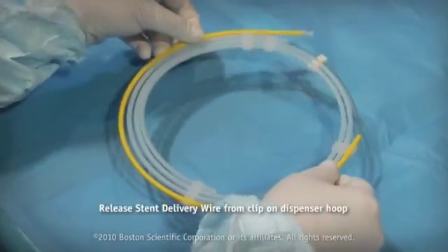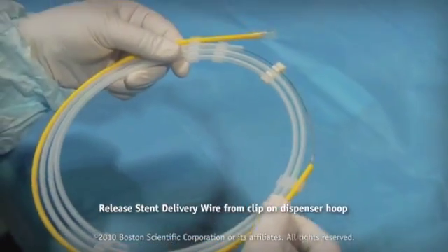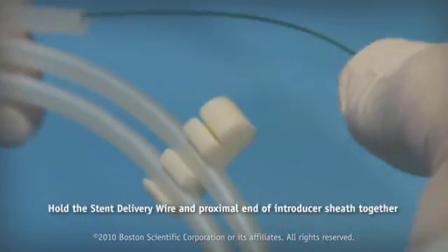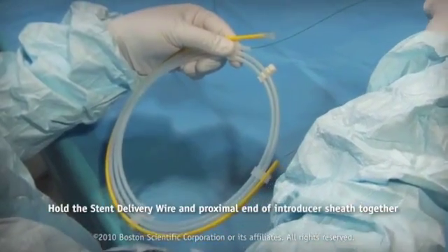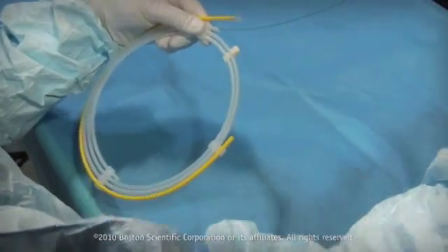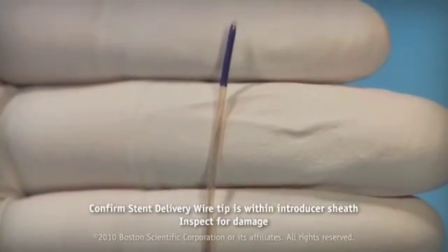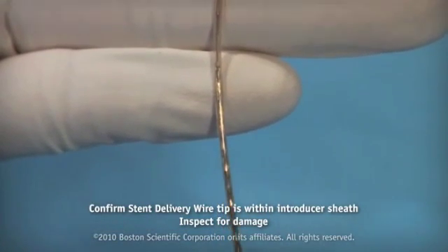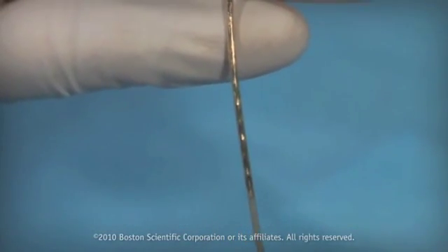Release the stent delivery wire from the clip on the dispenser hoop. Hold the stent delivery wire and proximal end of the introducer sheath together to prevent stent movement. Then carefully remove the system from the dispenser hoop. Confirm the tip of the stent delivery wire is entirely within the introducer sheath, is not kinked, and the introducer sheath tip is not damaged.